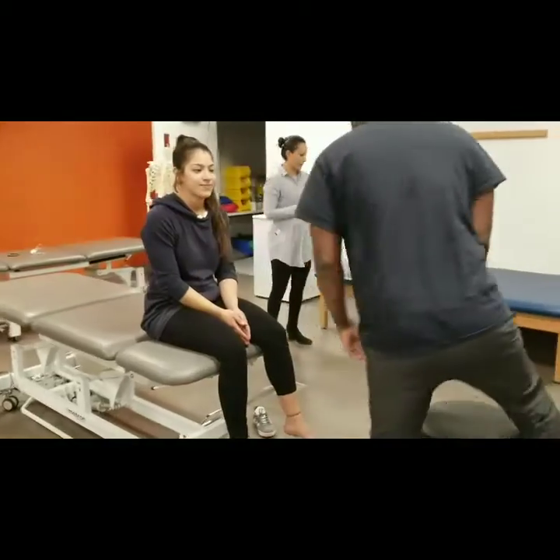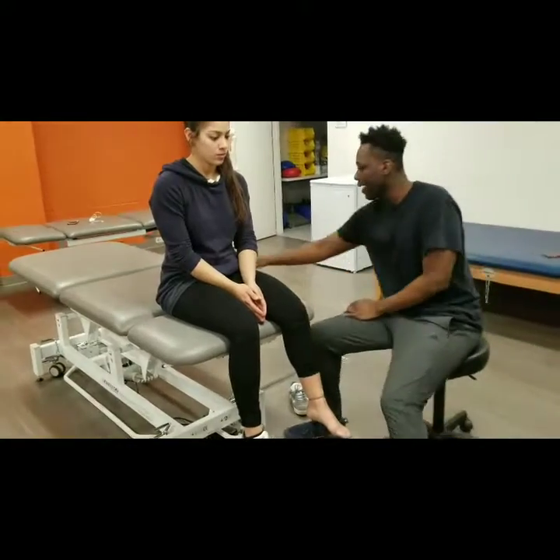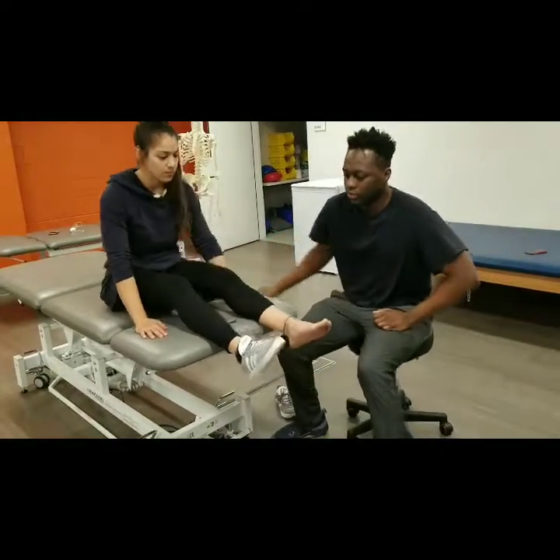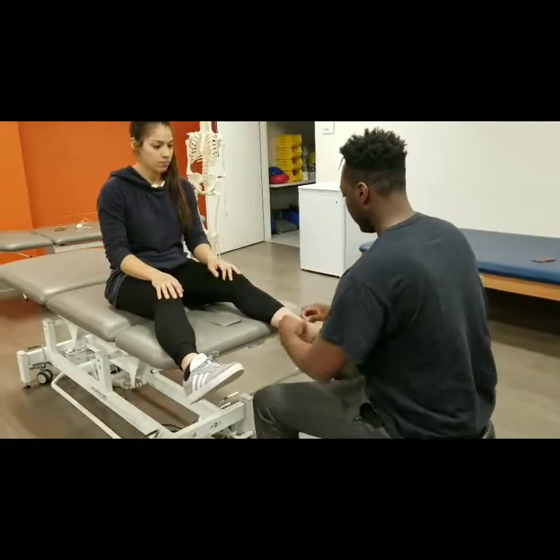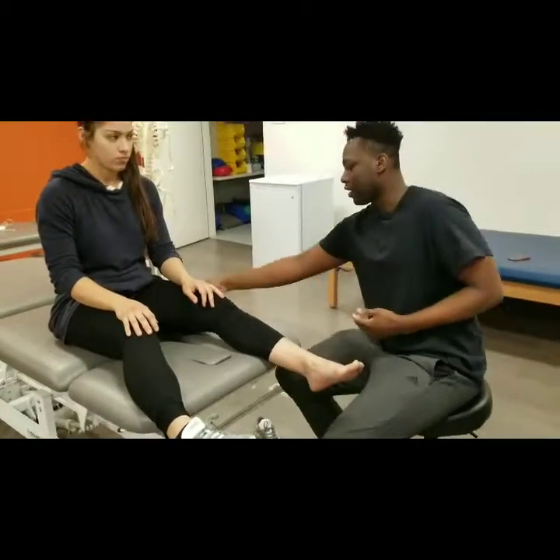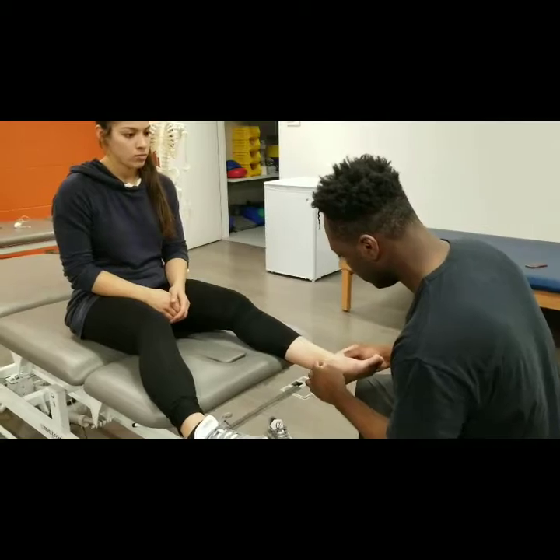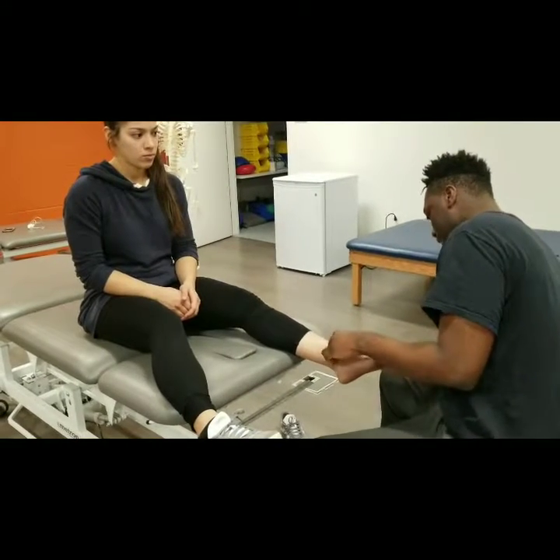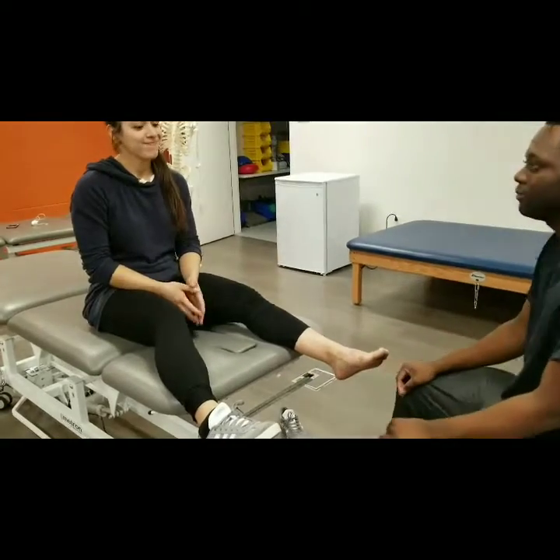Hi Jessica. So I'm just going to position you and then inspect your skin to make sure everything's looking great. I'm going to have you back up a little bit so your feet are hanging off. Good. Right now I'm just going to remove any jewelry or any items around it that could cause some trauma as well. Let me just inspect your skin here for any kind of infection. Everything looks good. So we're going to press.